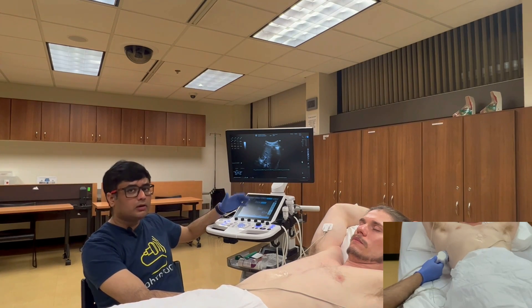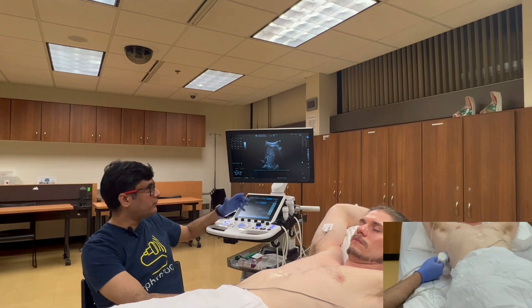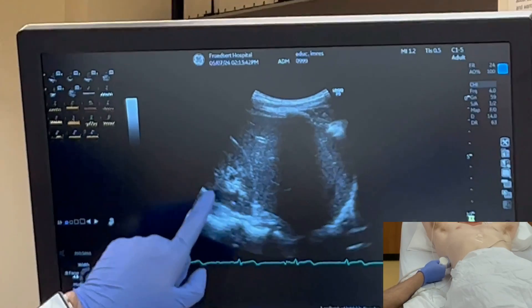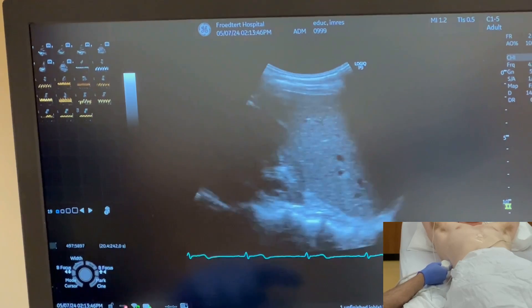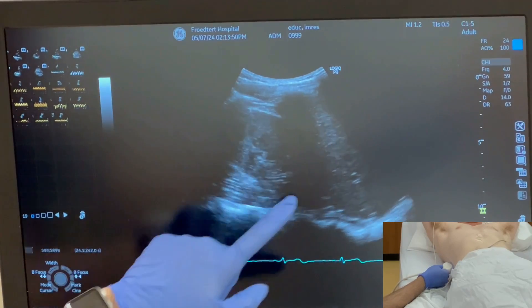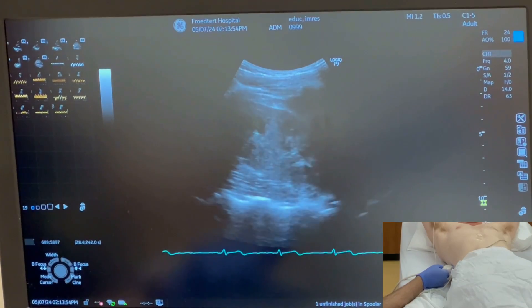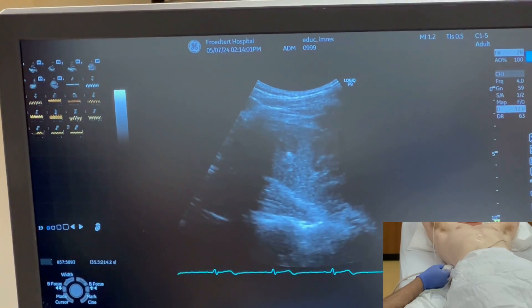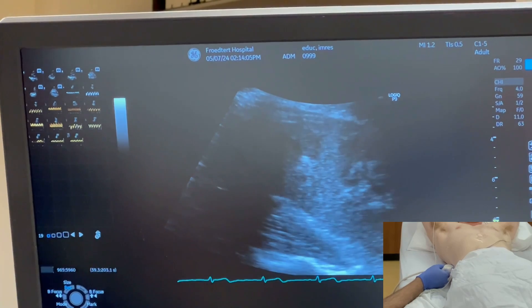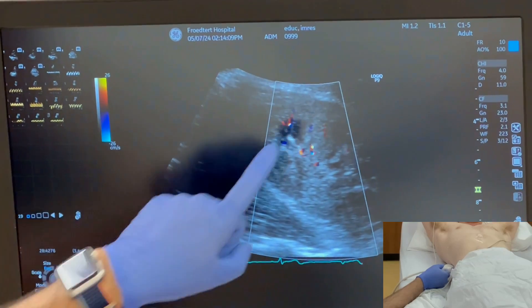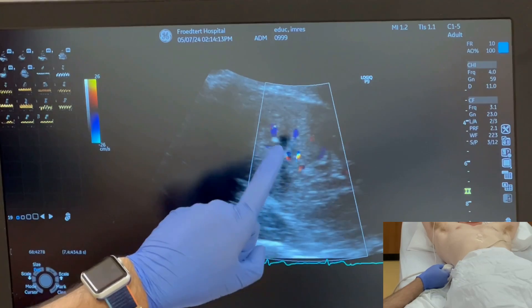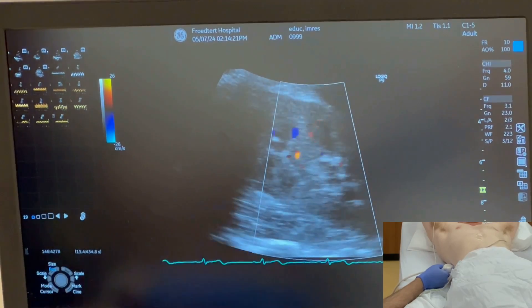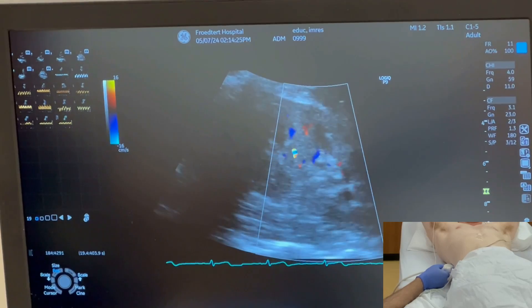You can sample either the right or left kidney, whichever is easy to find. The kidney is posterior, so I sweep the transducer posterior and inferior. Here is the kidney — because we are using the curvilinear transducer, there are some rib shadows you may or may not be able to escape with gentle probe rotation. I'll reduce the depth and zoom on the kidney, then put on color Doppler. We see some black structures which are medullary pyramids, and we want to sample the interlobar vessels running parallel to them. Lower the scale to about 10 to 15 for better color pickup.